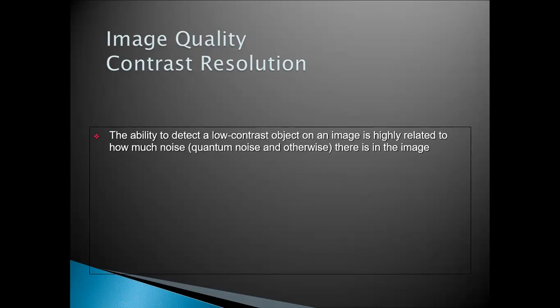It is related to the amount of noise. The more the noise in an image, the lesser the contrast resolution.